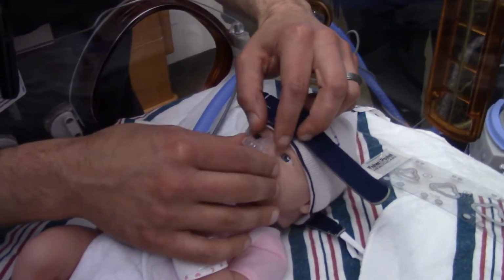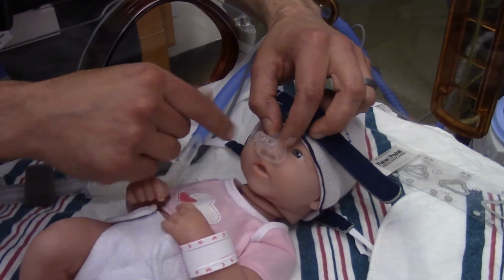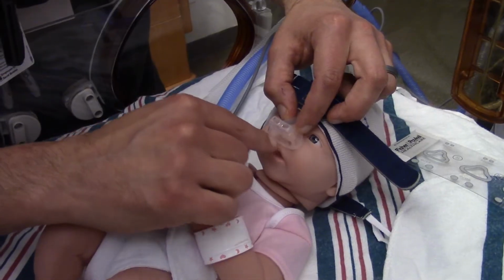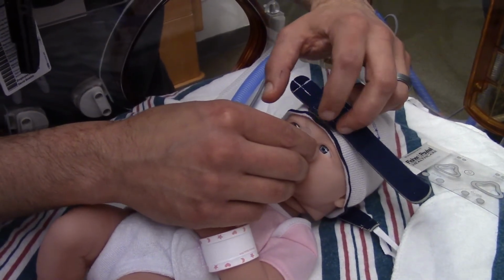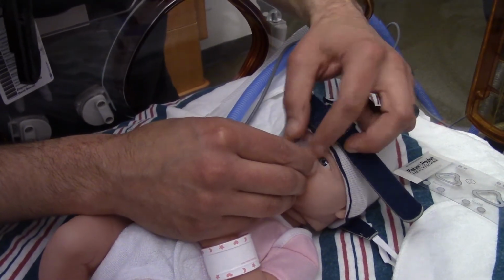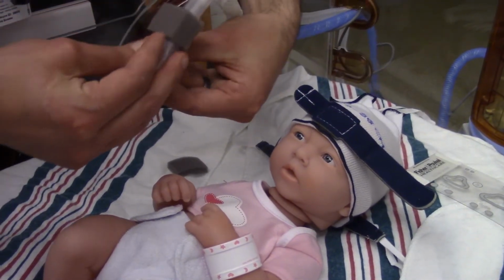So if we put the large onto the baby's nose, it's a perfect fit. We can see the sides of the nares. We're underneath the septum. We're encompassing both nares, and the mask is sitting right on the bridge of the nose without intruding into the eyes. So the large would be our go-to on this child.